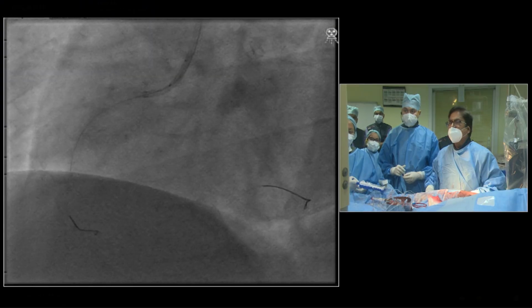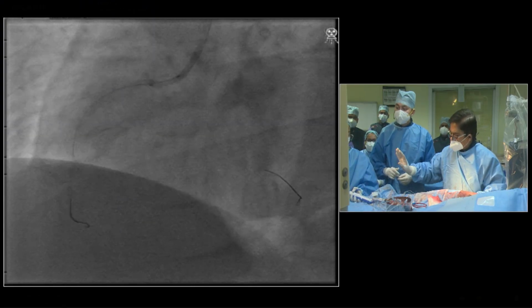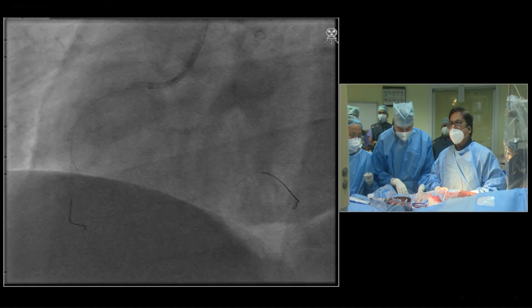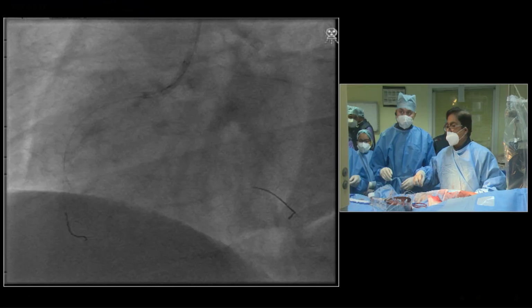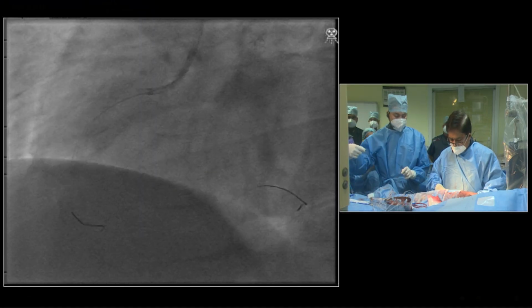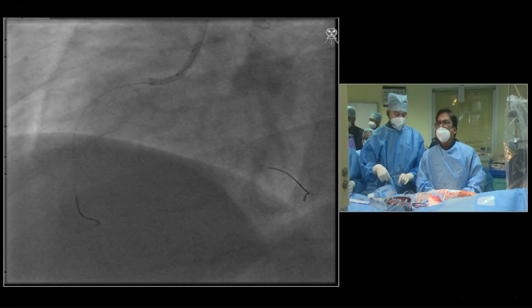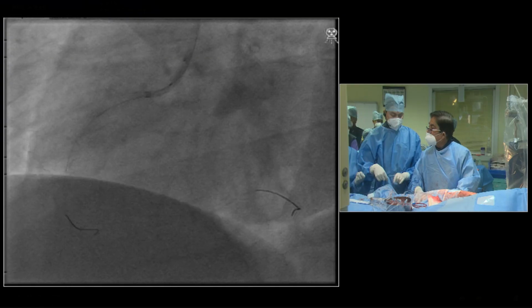Dr. Ramdev again is talking about the dock exchange that we used to use. But I think now most of us have moved away from dock to wire trapping. It becomes so much comfortable. You are in control as an operator, unlike a dock exchange where sometimes your fellow or someone who's helping you out may pull it out. So I think most of us are more comfortable with a wire trap rather than a dock nowadays, and it also saves the cost, I believe. Still, we can use a nando technique provided your microcatheter and the wire are very neat. Then you can easily use it provided you know the technique properly. But even I will advise better not to do nando, better to use a balloon trap.